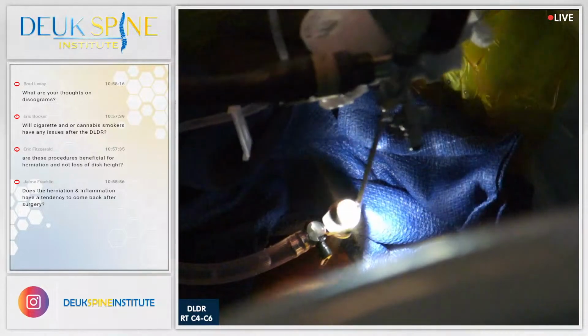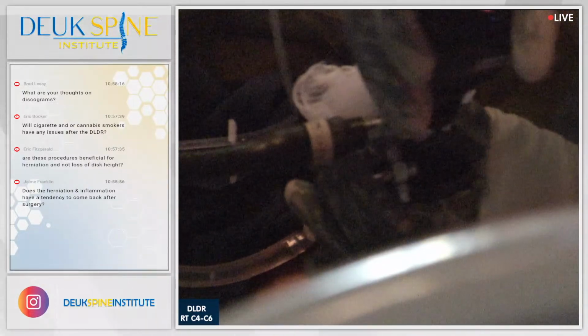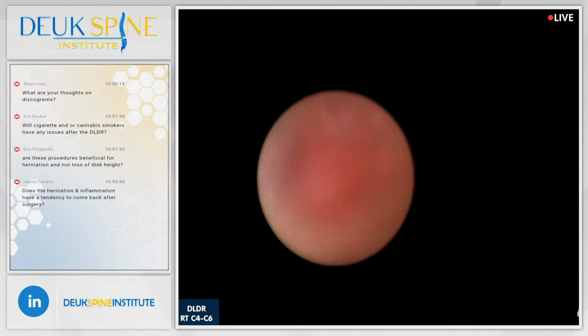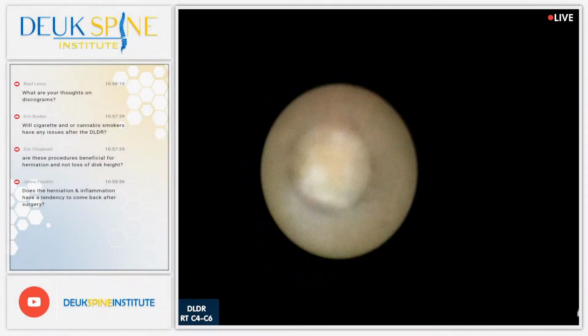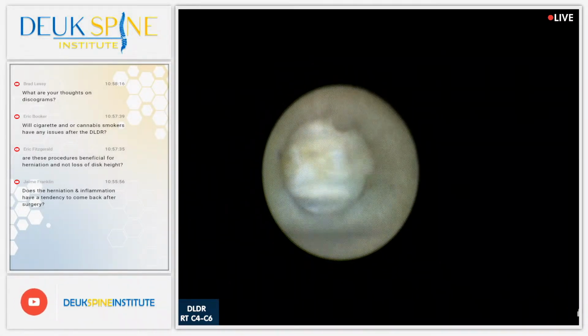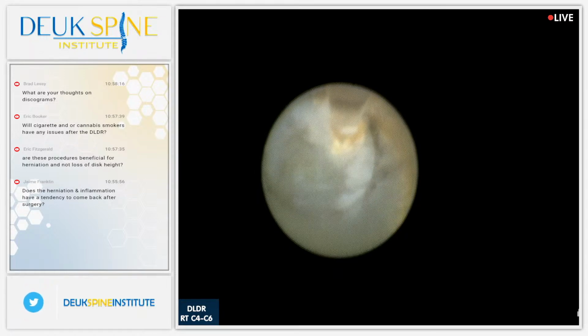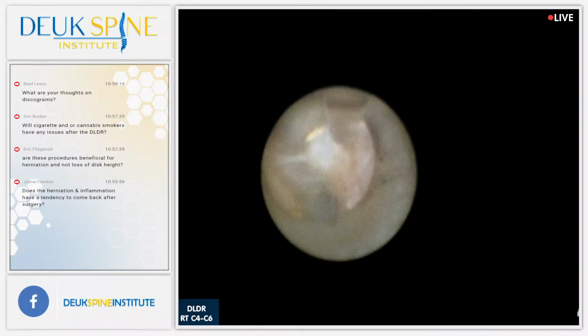No. Jamie, when I fix with Deuk laser disc repair, this surgery you're watching, herniation does not come back and the inflammation does not come back. Our patients get this surgery and they do well for the rest of their life. The only way they can get the herniation back is if they re-herniate. And that does happen in this surgery. 1% of our patients re-herniate.